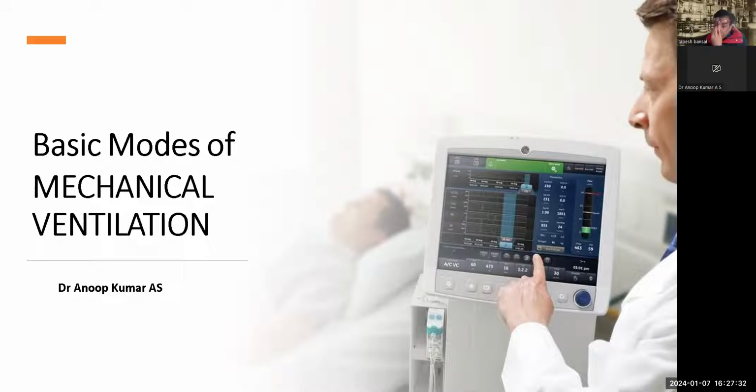And the second group will be like an ARDS type of lung, where the lung compliance will be poor and the patient will be having oxygenation issues. So our main strategy will be to keep tidal volume low, keeping the driving pressure somewhere around 15. And then we will have to maintain adequate oxygenation. And the third will be a patient with an obstructive airway disease like COPD or asthma. So there our peak pressures will be high, and our target will be to avoid auto-PEEP and to maintain minimum oxygenation.